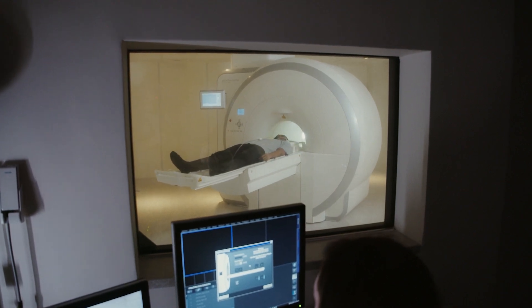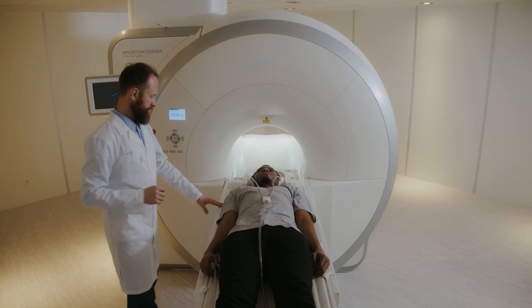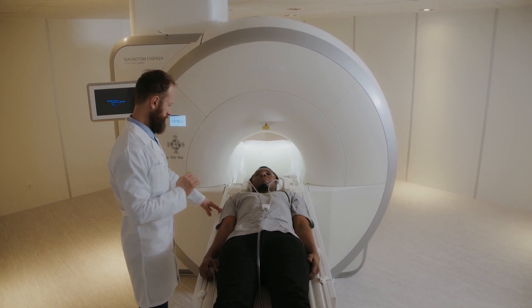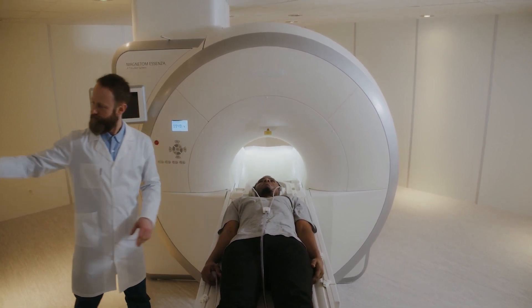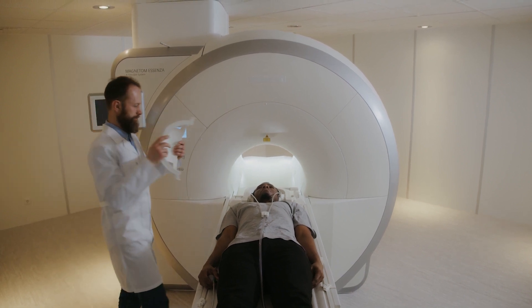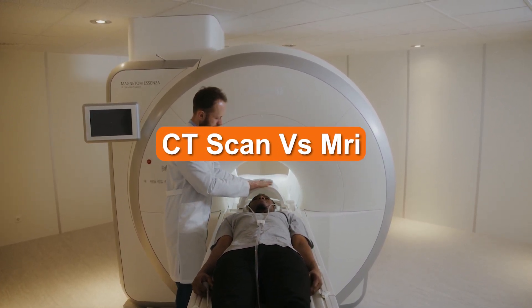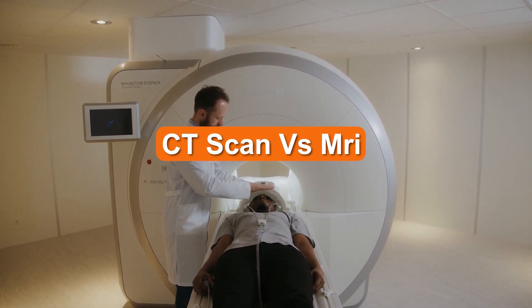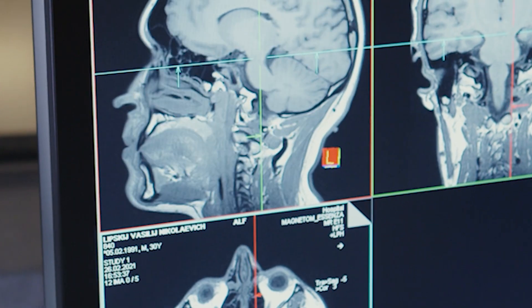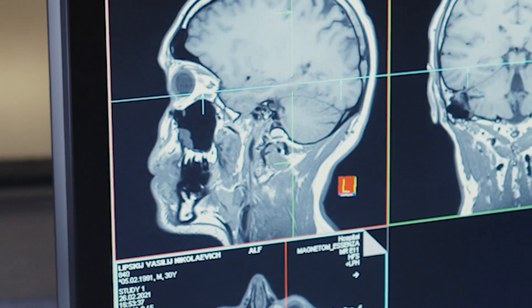A CT scan or CAT scan is best suited for viewing bone injuries, diagnosing lung and chest problems, and detecting cancers. An MRI is suited for examining soft tissue, ligament and tendon injuries, spinal cord injuries, brain tumors, etc. CT scans are widely used in emergency rooms because the scan takes fewer than five minutes.